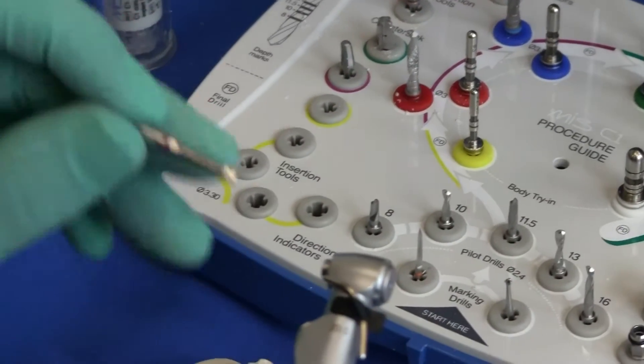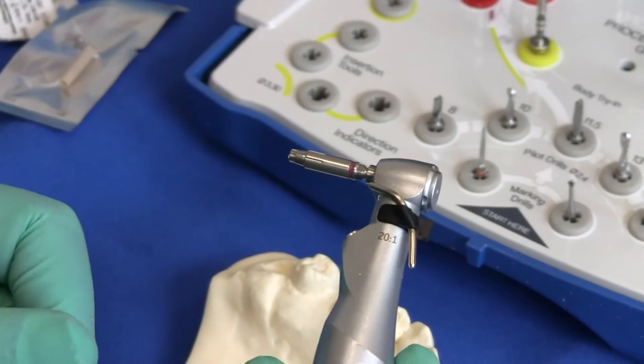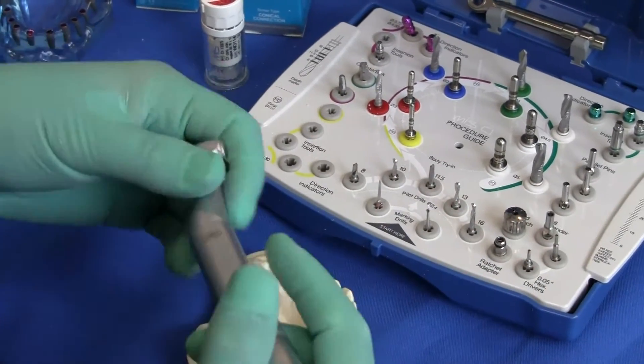Insertion tools come in long and short variety. Here I have the long one. I have my motor on slow speed implant setting.